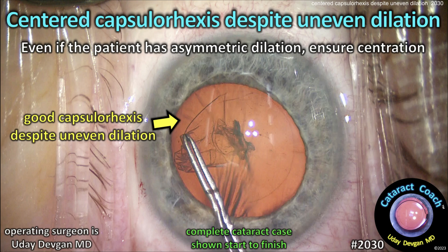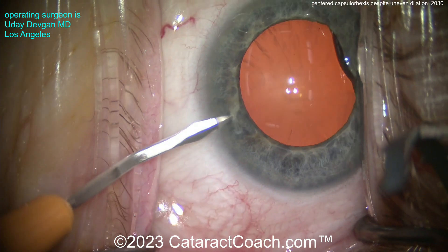cataractcoach.com. A centered capsulorrhexis despite uneven dilation. Even if the patient has an asymmetric pupil, you need to ensure centration of your rhexis.